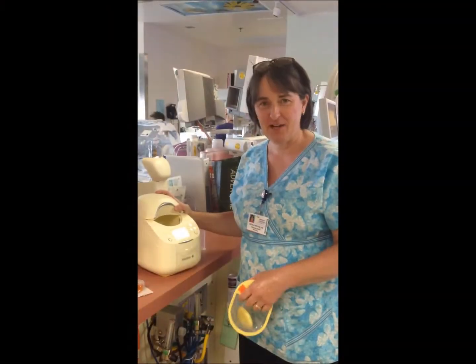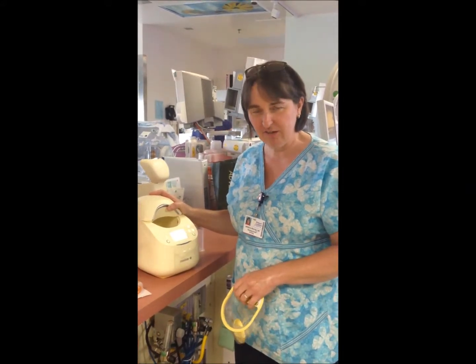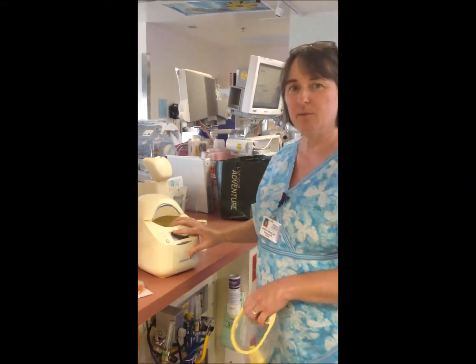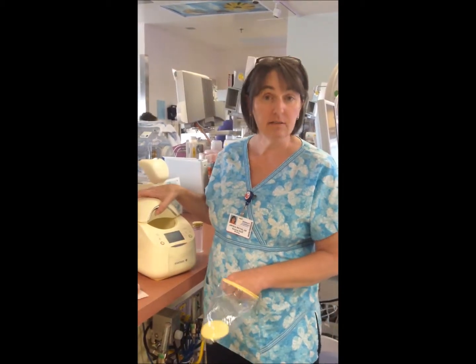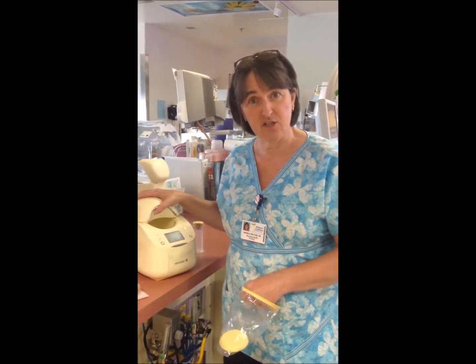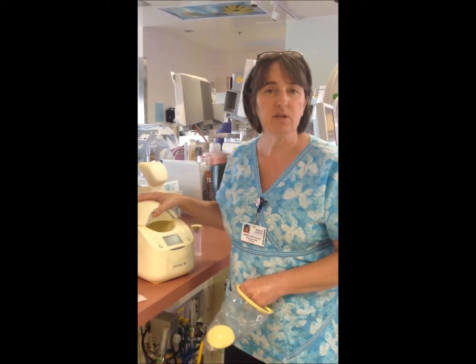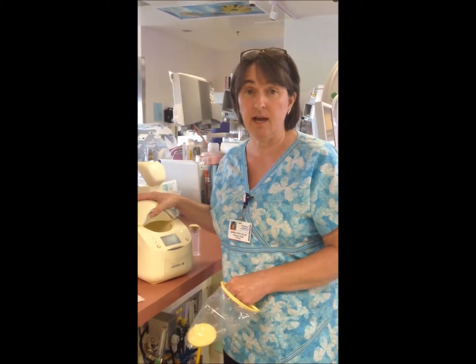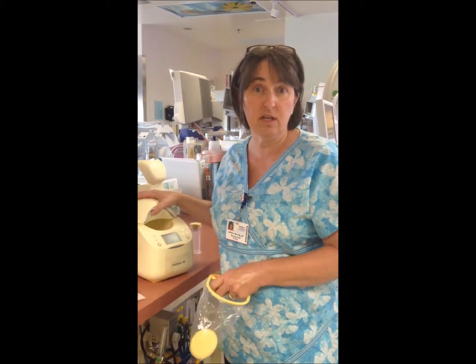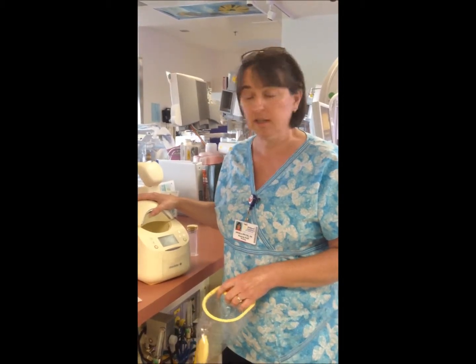Hi, my name's Angela, and I'm one of the lactation consultants here at Fletcher Allen NICU. And I want to just tell you about our breast milk warmers. We used to use hot water, and the danger with that is there's a risk of infection, contamination from the water, and there's also inconsistent temperatures. You can warm the milk so that it's dangerously hot and destroy some of the benefits, or it's still too cool and that's bad for the baby in terms of digestion.